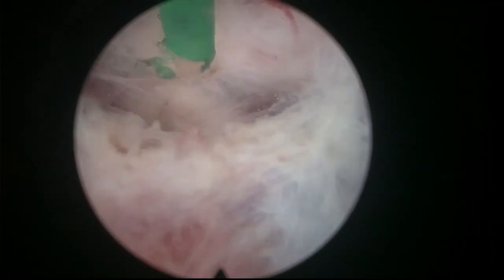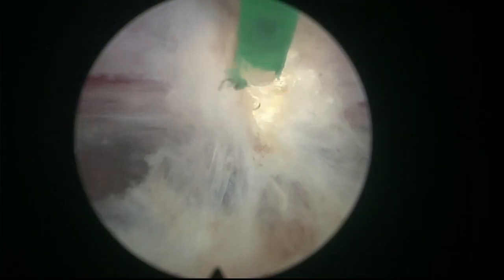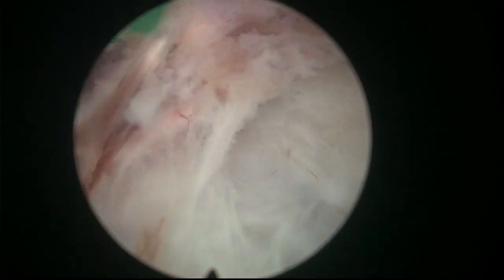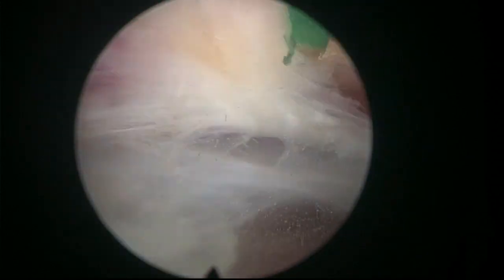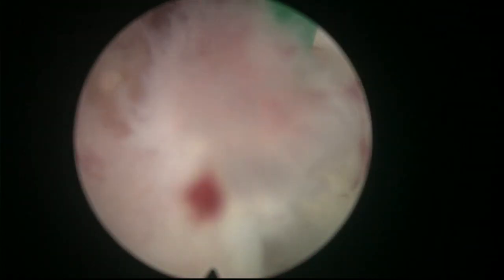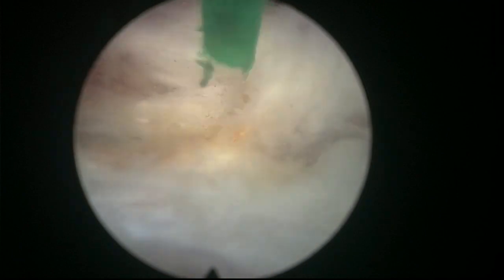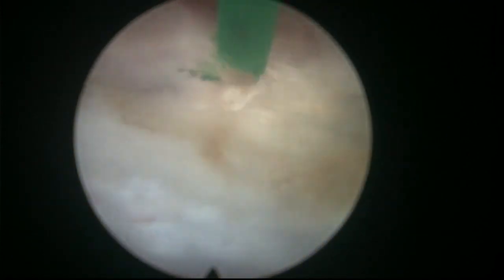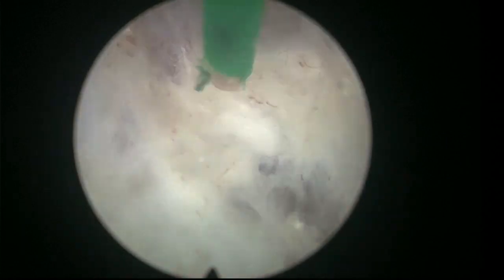Here, this is the area that we found at the beginning that looked a little bit thin. So if we're close to the adenoma, that looks thin too. Let's see if we can find a proper plane down here. That looks like a very good plane, so we try to follow on that level. We're trying to correct a little bit the plane so we don't go too deep in that region. You see here, it looks as if this is a thin plane, but by correcting a little bit, we will manage to get a better plane for the continuation of the dissection of the posterior plane. There we are. We're progressing quite nicely.